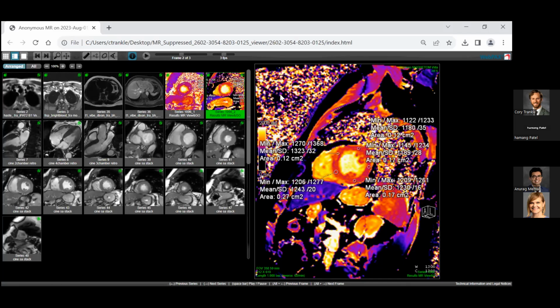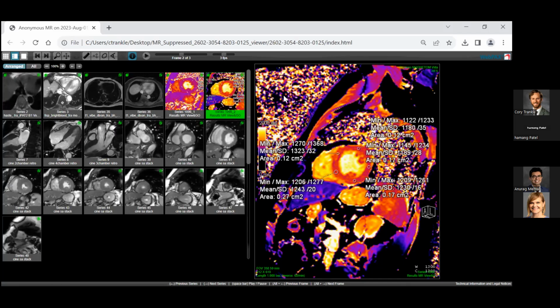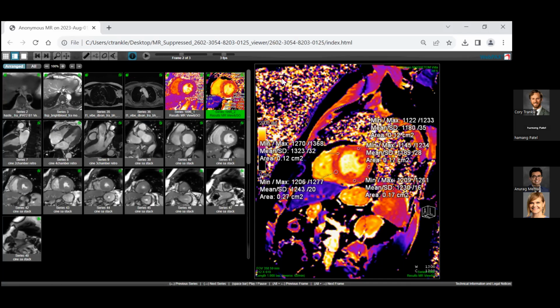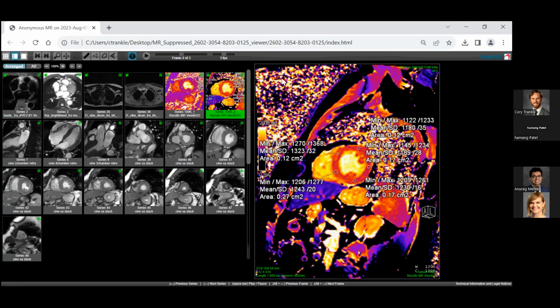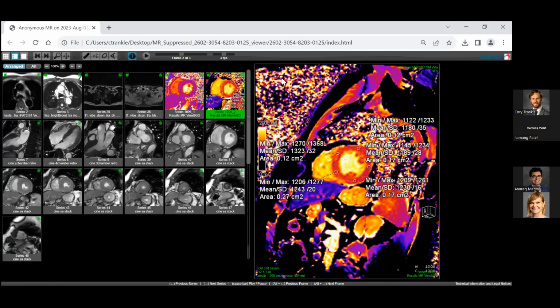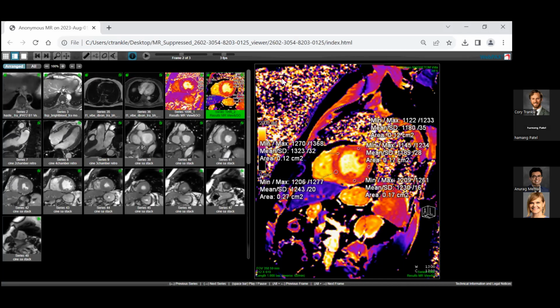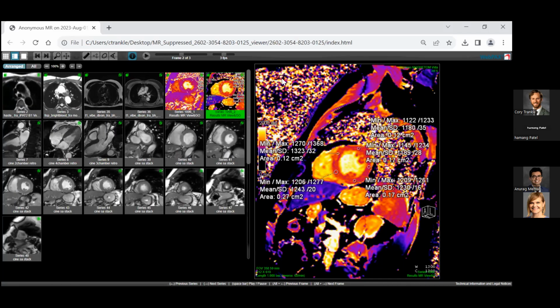But the reason I want to point that out is to look at what comprises the image. It's lots of little cubes. Now in 2 dimensions, when it's displayed on your screen, it's squares, right? So what makes up this picture are lots of little cubes. So let's go back to the white screen now.